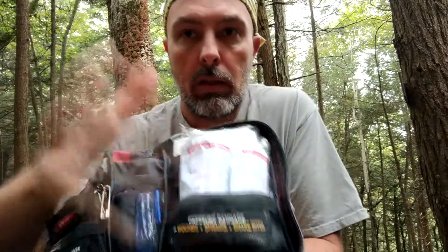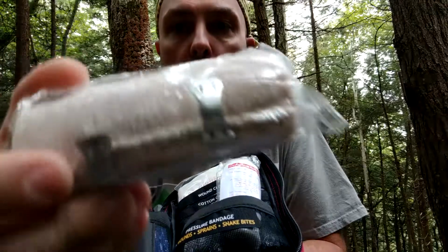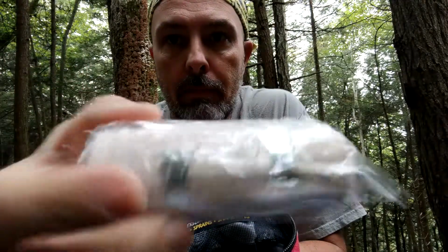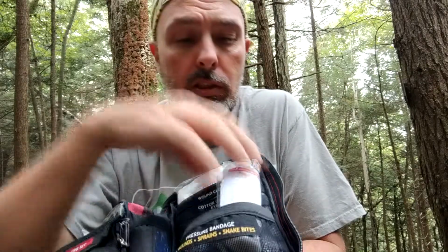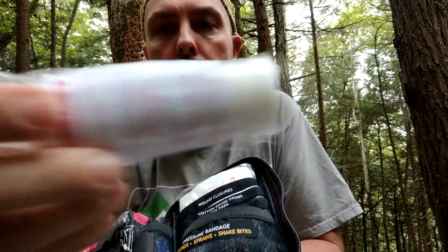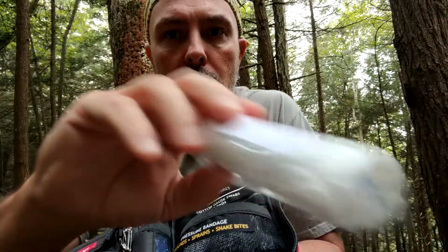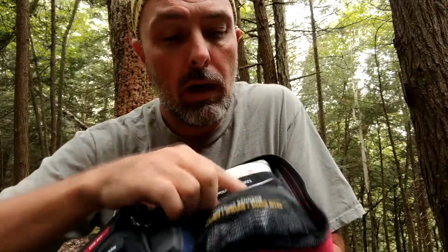On the other side, in the big pouch here, you've got a couple different kinds of bandages. Like an ace bandage with the little metal clips in there for sprains and things like that. And then you've got another conforming bandage, like a gauze bandage. So that's nice to have. And you've got the shears on this side so you can cut it.